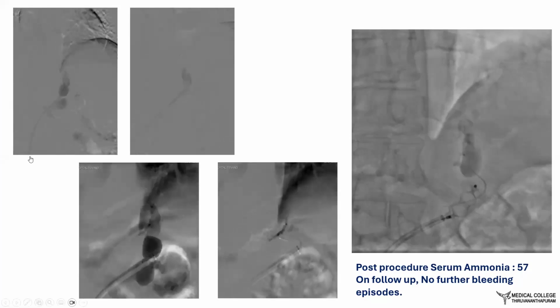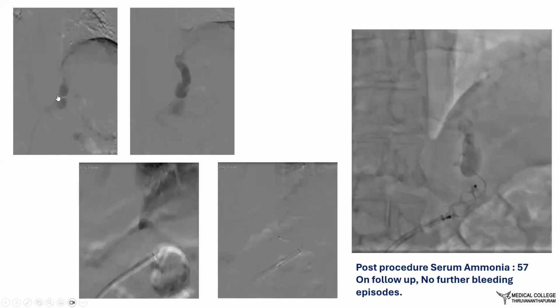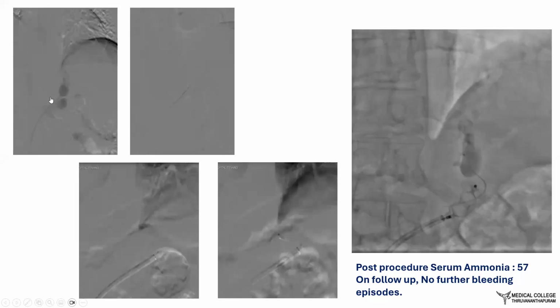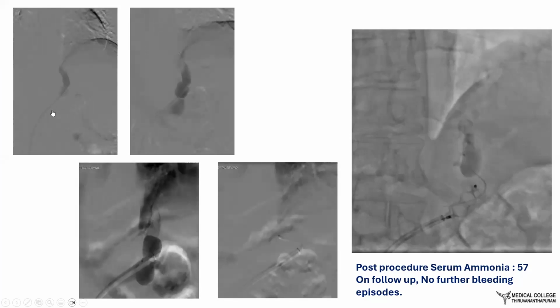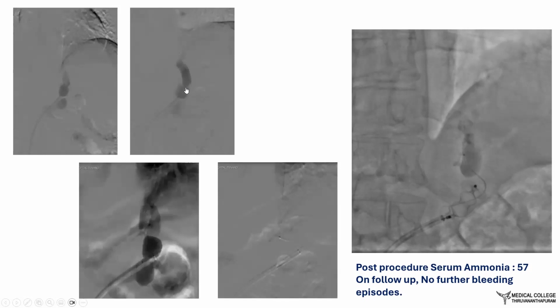So generally what we do is we go through the femoral access. We put a long sheath. Initially, we were using the Cook shuttle sheath, which we have found is a bit difficult to navigate deeper into the vein. So now we have shifted to the hydrophilic coated destination sheaths, which even 8 French will go relatively smoothly when compared to the Cook sheath deep into the varices. So this was pushed into the gastric varices, and the procedure remains the same.